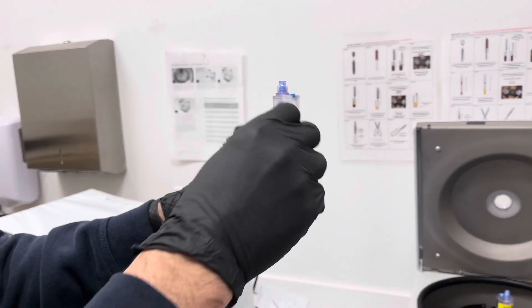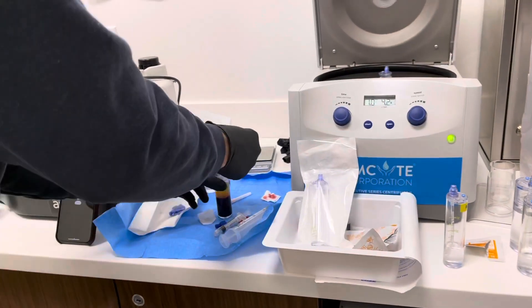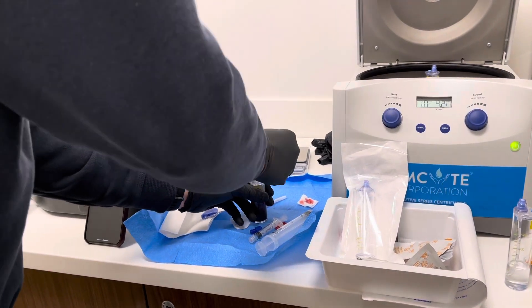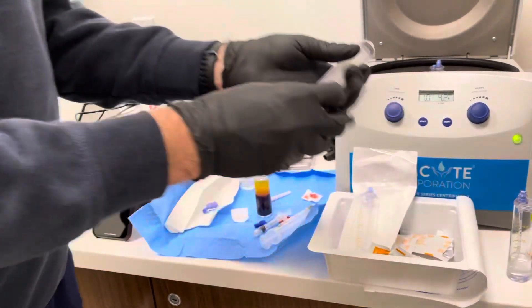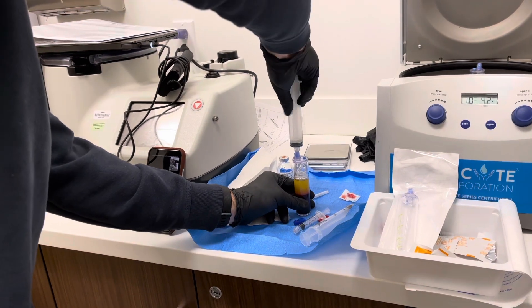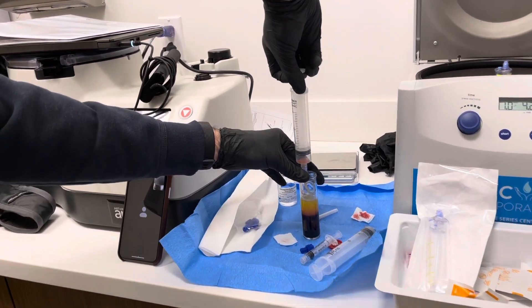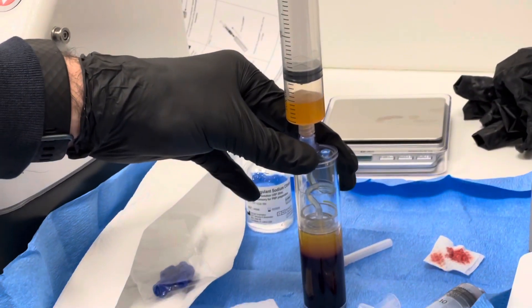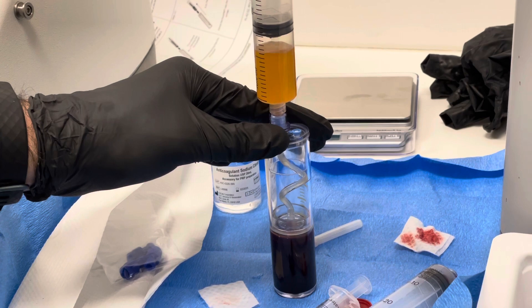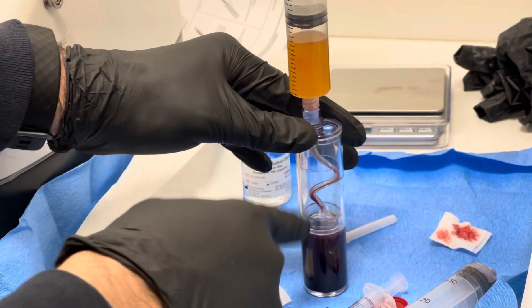Being very careful not to shake or rock it too much, pop it down there and give the top a quick clean. Then taking the next biggest syringe — you work from big ones down — attach that here, and you're just going to draw from the top down. We only want the plasma; we don't want the red cells. When you get good at this you can get quite close, then slow right down and you'll see the red come up the line. You see the red came to the top of the tubing — so I've got all the plasma without taking any of the red cells.